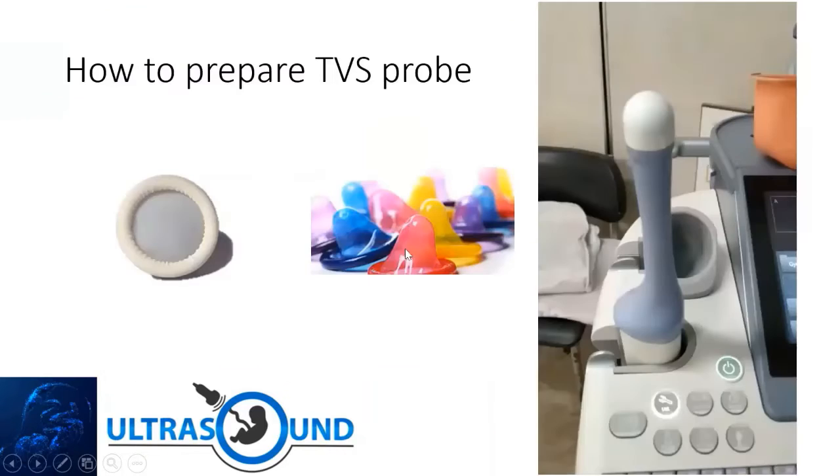Okay. And I would also want to tell you it is a little bit important to know how to prepare the TVS probe. Okay, so as you can see, most of the time we use a condom, but in fact there is a medical protective cover, which is just a dome without this bubbling up here, like a condom. So most of the time, the beginners' issue is they did not empty the air here. So when you have an air bubble in between your probe and the target organ, you will have a lot of artifacts and you cannot have a good image.